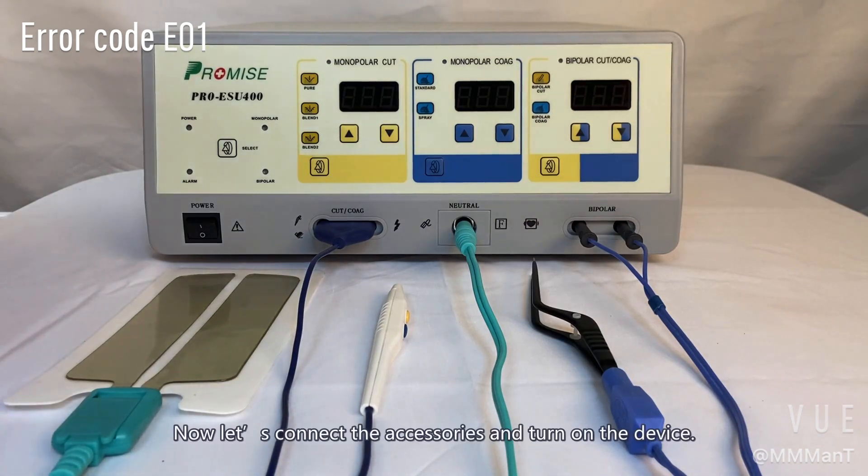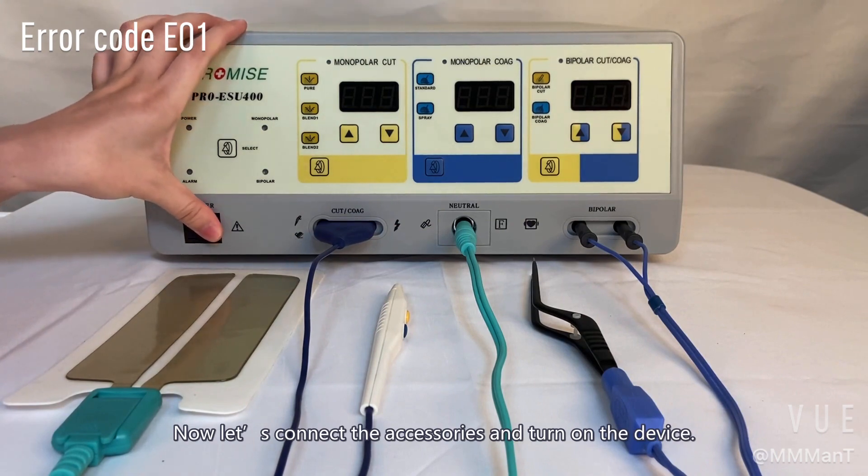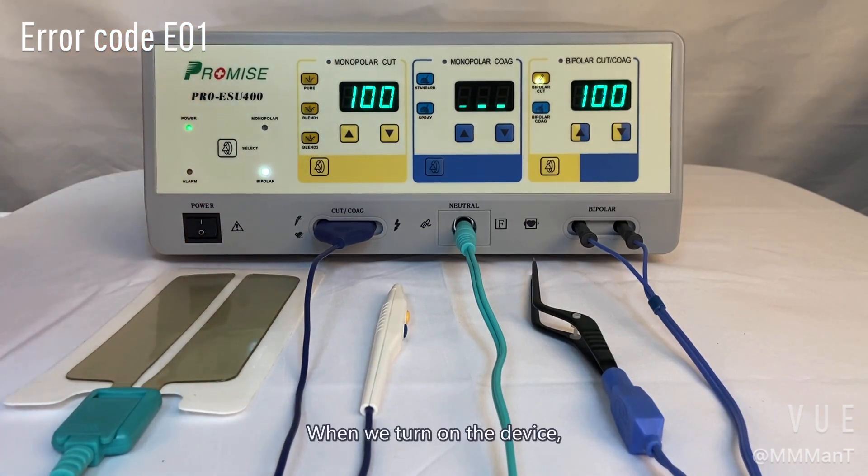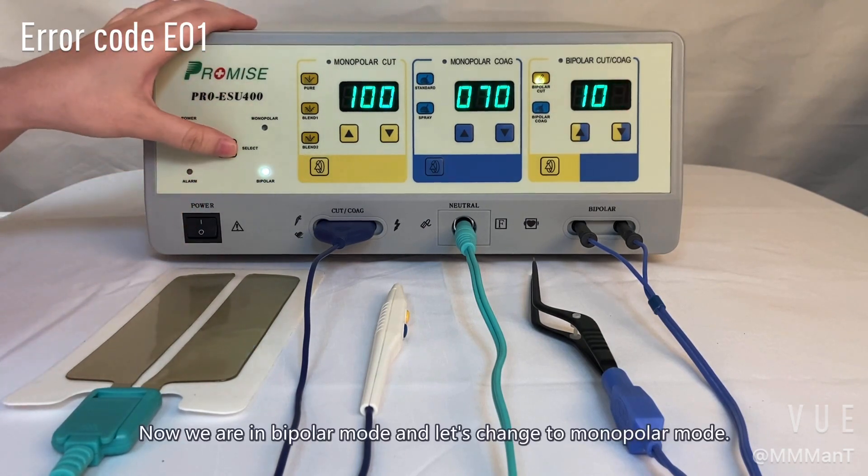Now let's connect the accessory and turn on the device. When we turn on the device, it will go through a self-test of about five seconds to make sure the connection is good. Now we are in bipolar mode and let's change to monopolar mode.